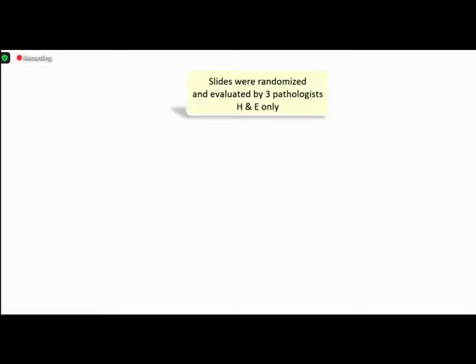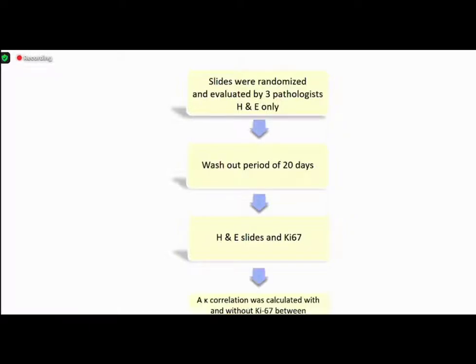So after selecting these slides, we randomized these slides and I requested three pathologists to review them, first with only H&E slides and come up with a diagnosis. Then after a washout of 20 days, we requested the pathologists again to review these slides with H&E and Ki-67 combined.